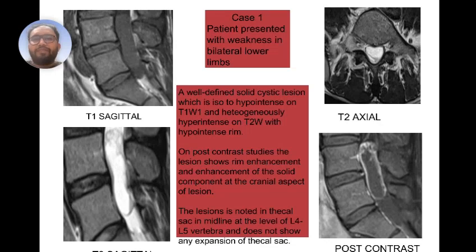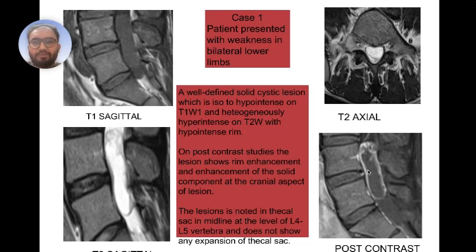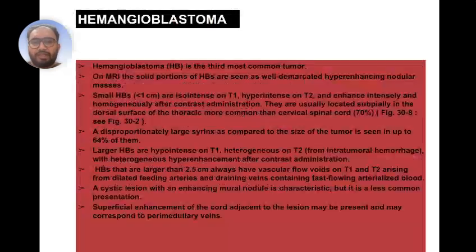Case 1: Patient presented with weakness in bilateral lower limbs. A well-defined solid cystic lesion is seen, which is iso- to hypo-intense on T1-weighted images and hyper-intense on T2-weighted images. On post-contrast study, the lesion shows rim enhancement and enhancement of the solid component at the cranial aspect. The lesion is at the thecal sac in the midline at L4–L5 vertebral level and does not show any expansion in the thecal sac.